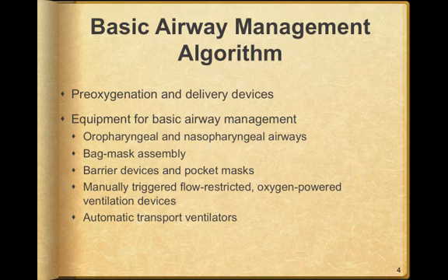Basic airway management algorithm, pre-oxygenation and delivery devices. In pre-oxygenation, it should be supplemental oxygen. We're going to look at those here in some pictures and talk about those: nasal cannula, non-rebreather mask, things like that.